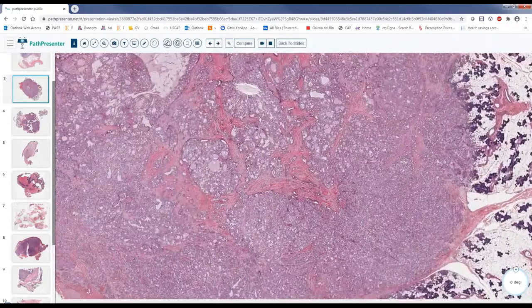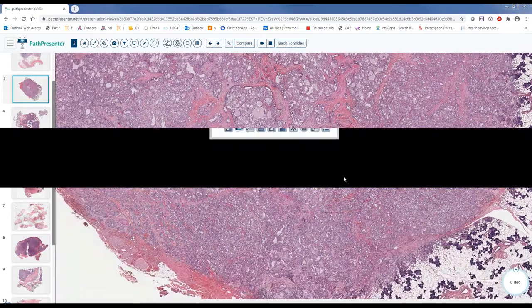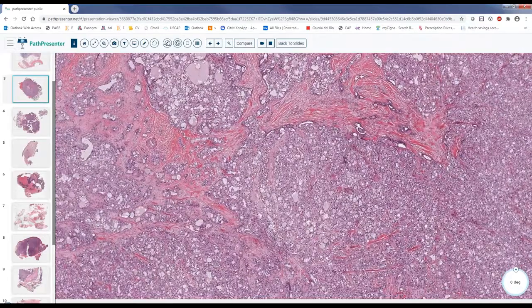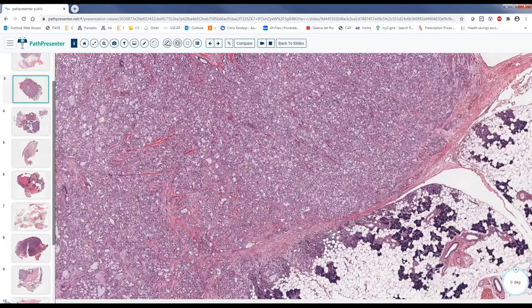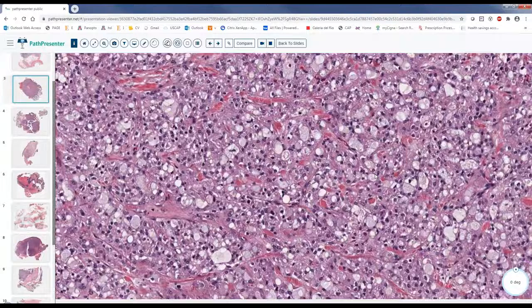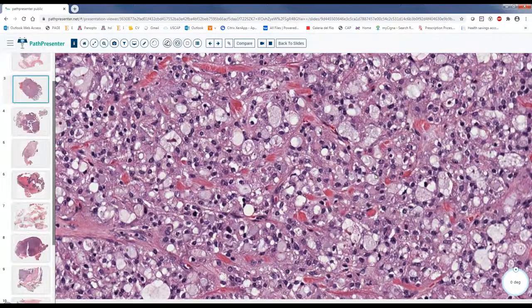It kind of looks homogeneous; the cells look alike. It's not much of a difference. So we'll go just in one area here. Anybody would like to give any description? Yeah, there's a thin capsule. I agree with that. So okay, when you have cells like that, it is monophasic, I guess.